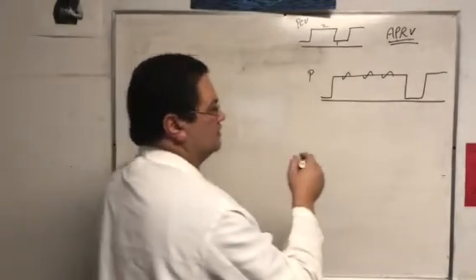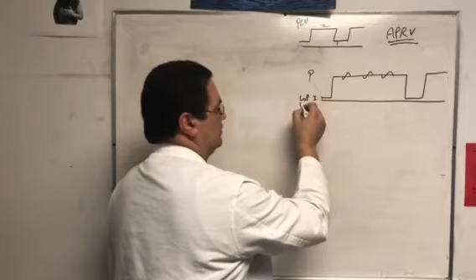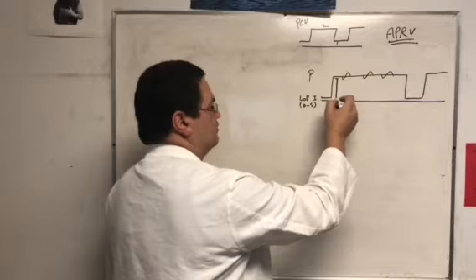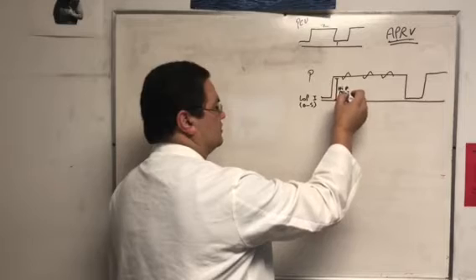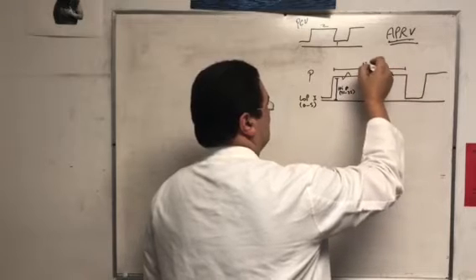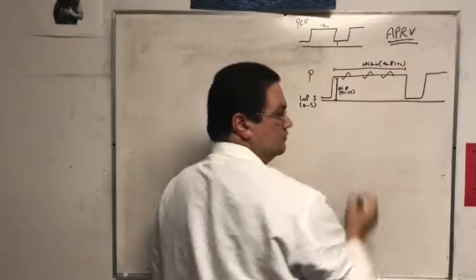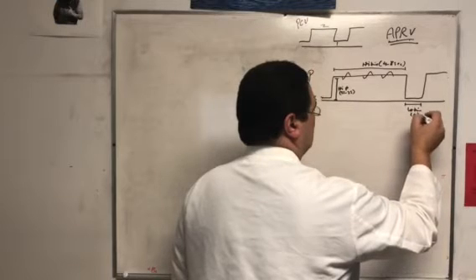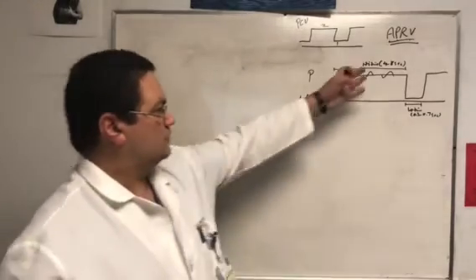So let's talk now about the set parameters. The first thing is low pressure from here to here, and that ranges between 0 to 5 centimeter water, which is very low. The second thing is the high pressure, from the top here all the way down to 0, and that ranges from 25 to 35. Then from here to here, that's the high time, and that ranges between 4 to 8 seconds. And then from here to here, that's the low time, and that ranges between 0.3 to 0.7 seconds. Very short. This is obviously very long.